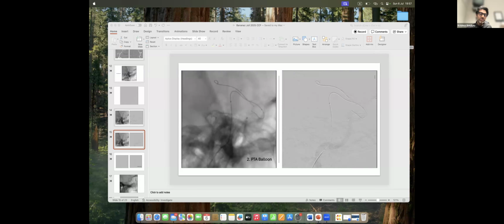I have no experience using these devices, but the senior neurointerventionalists certainly love them. Dodi, can you speak to your experience about detachable balloons in this situation? Yeah, even better. The good thing about detachable balloons is that they go straight into the hole, you inflate it, and they occlude, and you have a wonderful vision of the anatomy immediately, and then you can decide to detach it or not. Usually when you detach it, it moves, so the perfect result you had immediately changes a little bit and the fistula reopens.